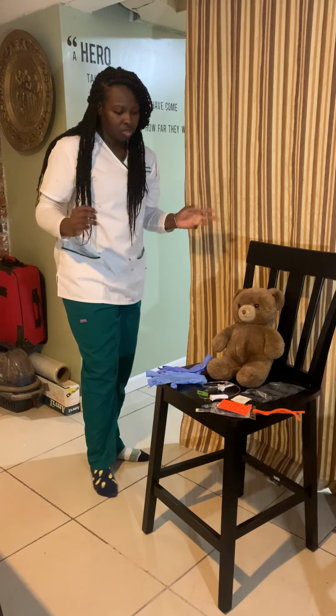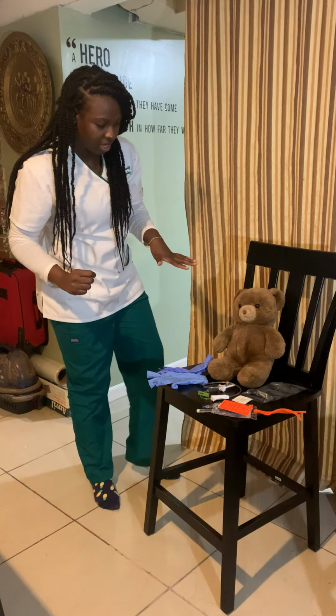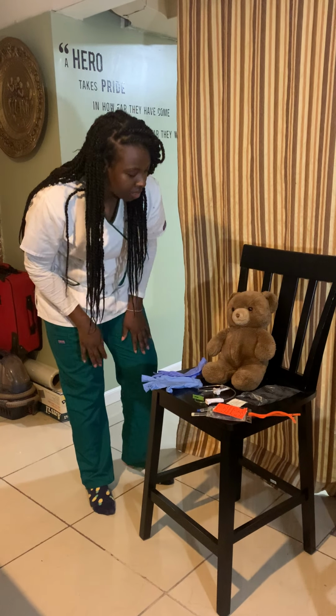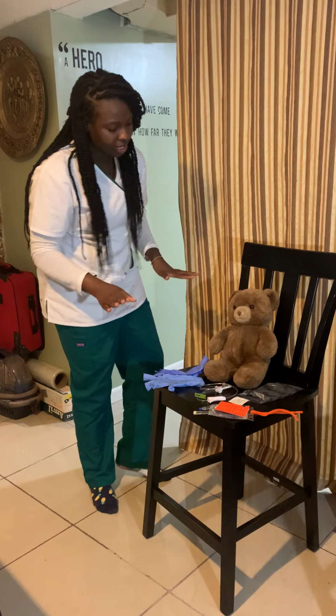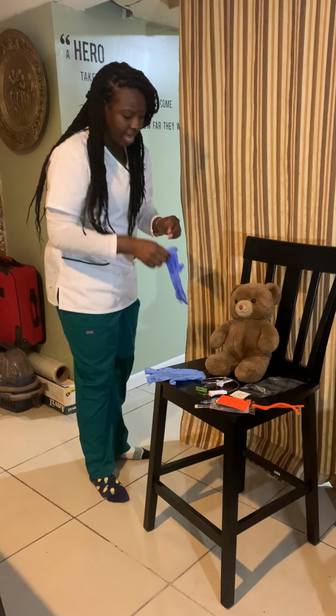Okay, so now I'm going to assess the patient's existing IV lock. I'm just going to make sure that the site is not edematous, red, tender, or painful. And at this point, I'm going to don my gloves again.